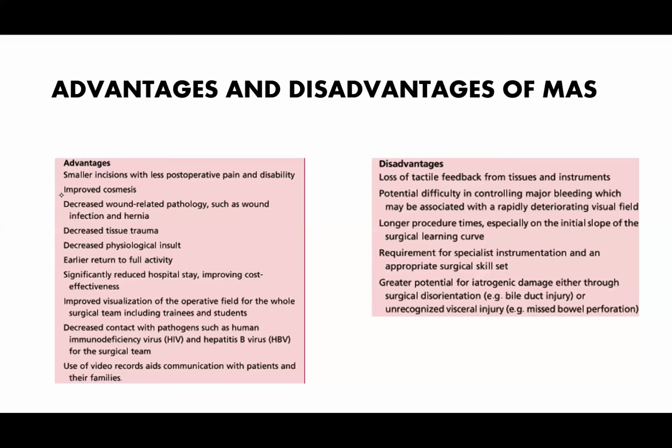Now, there's decreased contact with pathogens such as human immunodeficiency virus, HIV, and hepatitis B virus for the surgical team. Use of video records aids communication with patients and their families.